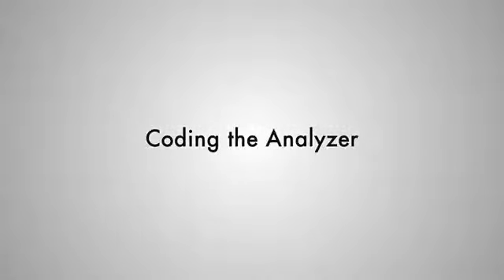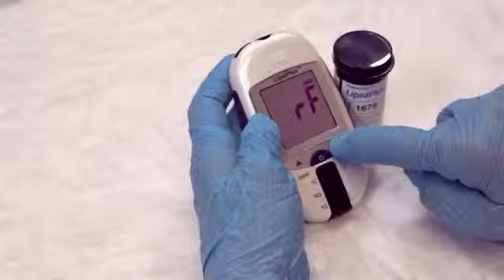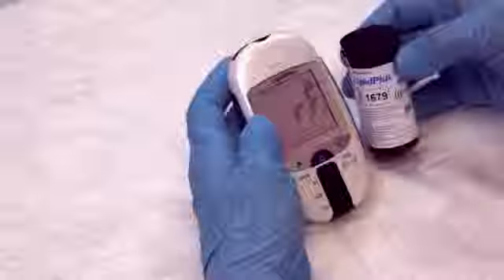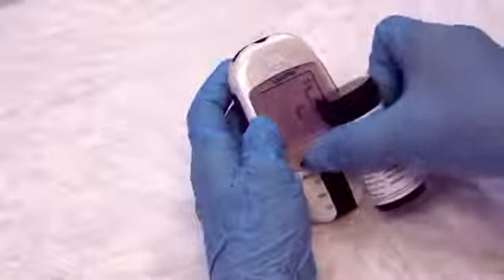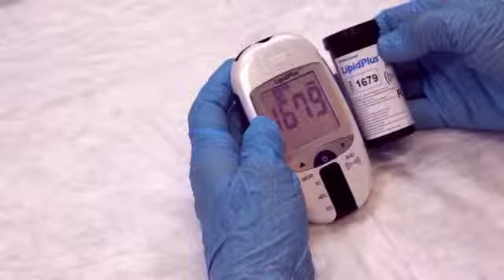To begin cholesterol testing, first code the analyzer. Press and hold the down arrow button for 3 seconds. The code RF will be displayed on the screen. Next, place the RFID tag located on the strip bottle label next to the RFID symbol on the analyzer. Once the RFID code is recognized, the analyzer will beep and display the code value for 2 seconds, and then return to standby status. Your analyzer is now coded for cholesterol testing.